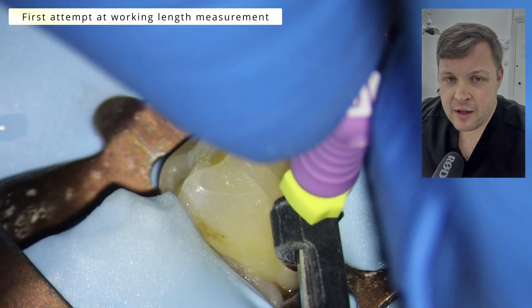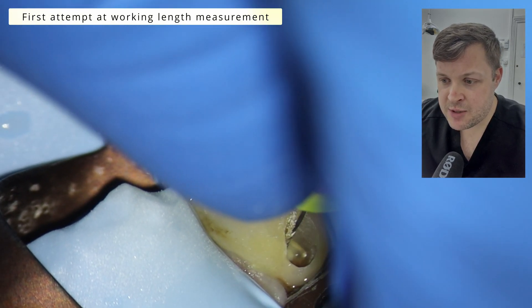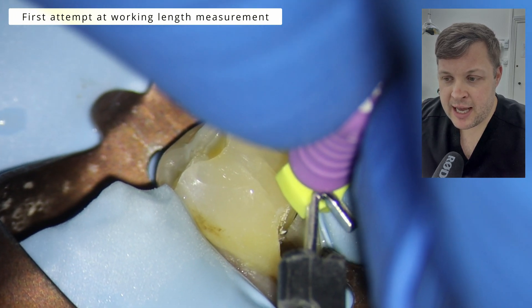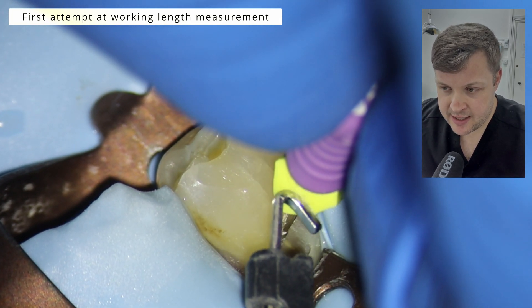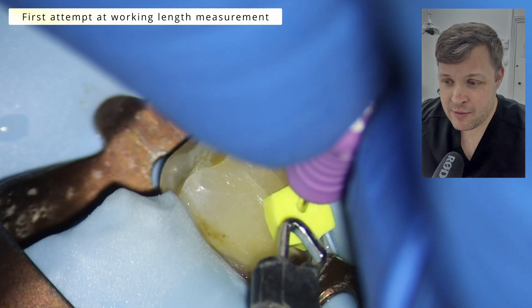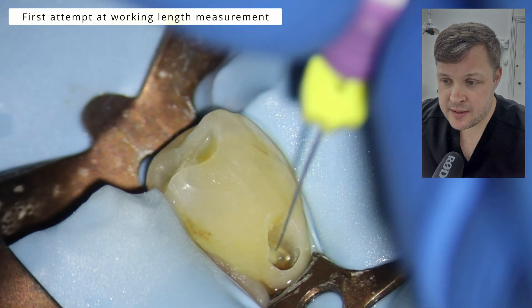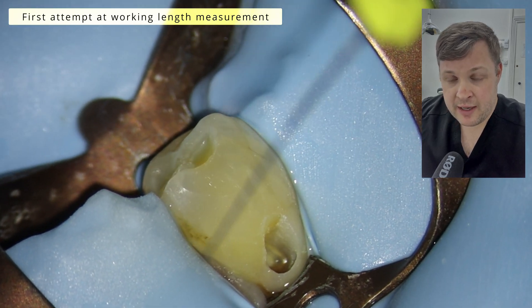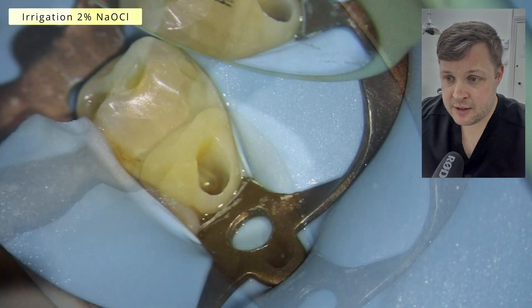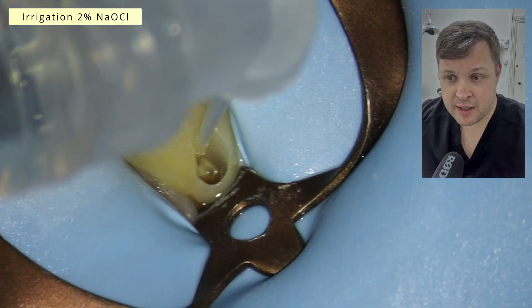I thought I could take a working length measurement with my apex locator quite easily, but in this case I couldn't quite get the zero reading on the apex locator. So I'm not going to push the file too far — I'm going to measure the K-file to see how far I got.